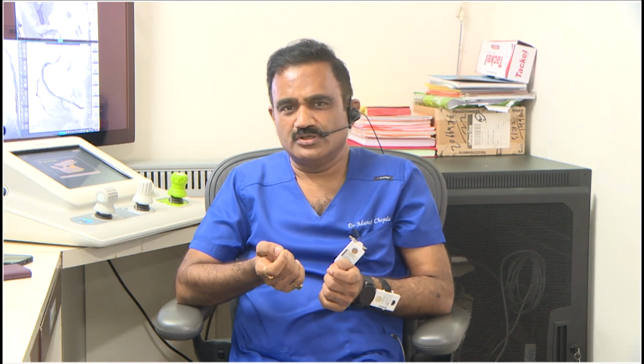Initially, we started with type A lesions, and now we are doing type B, type C lesions, bifurcation, long segment stents, CTO lesions successfully. In acute coronary syndrome also, we are using robotics in many cases, because wherever we have to put long stents or ostial stents, the 1 millimeter movement is very good. So placement of stent at the ostium becomes easy. With long stents, catheter and wire can be fixed. That's why we can put 48, 50 or 60 millimeter stents easily.